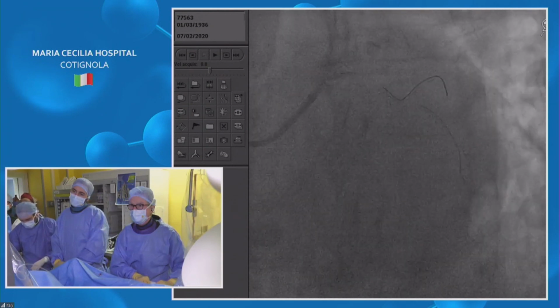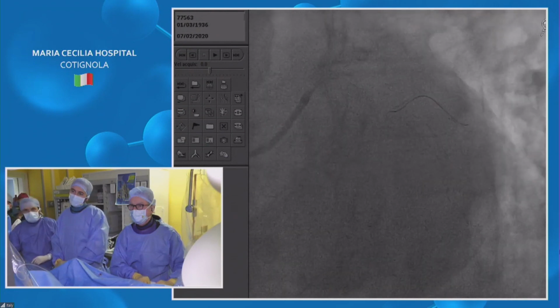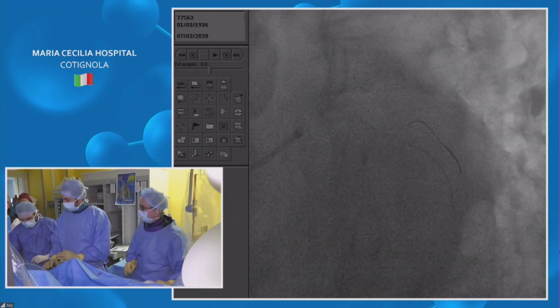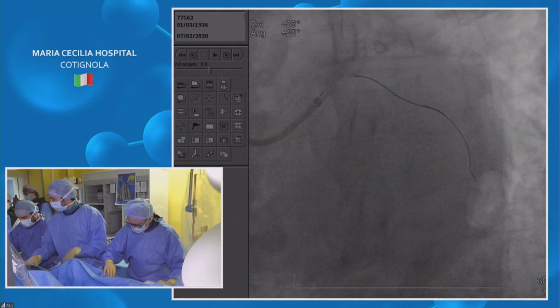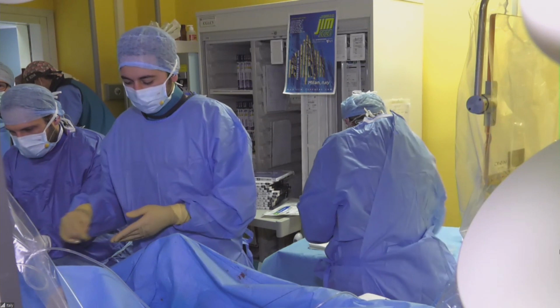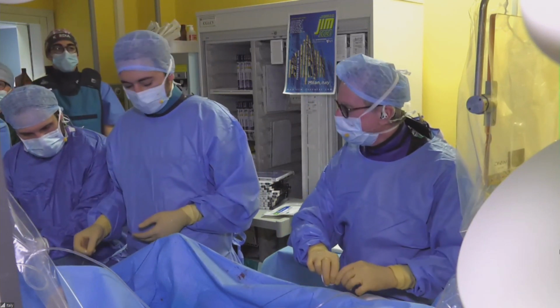Okay. Yep, true. Okay, let's, should we predilate? Let's do an IVUS. We have IVUS, let's do it. Let's see if we need to predilate.